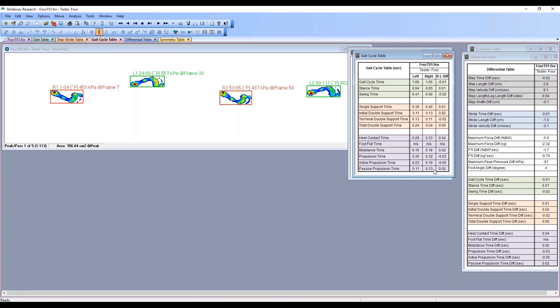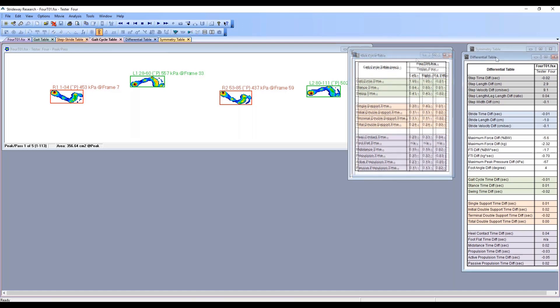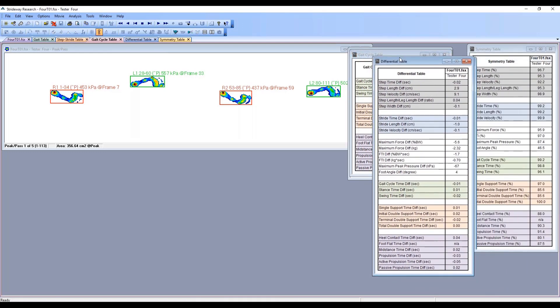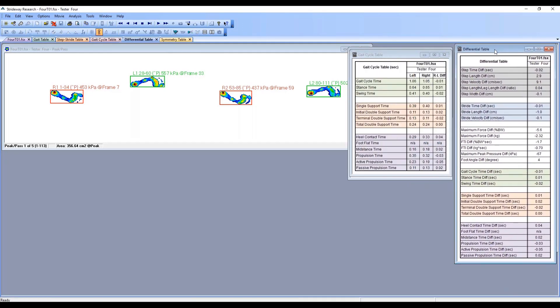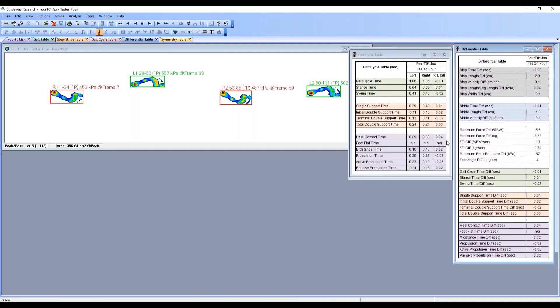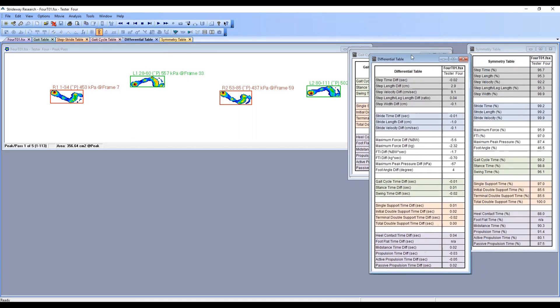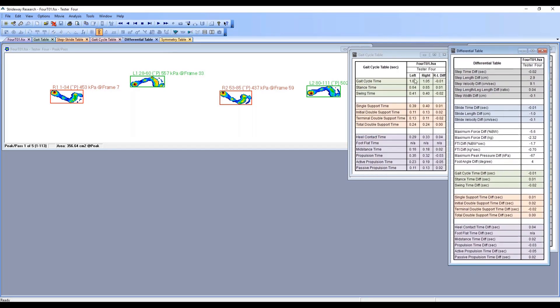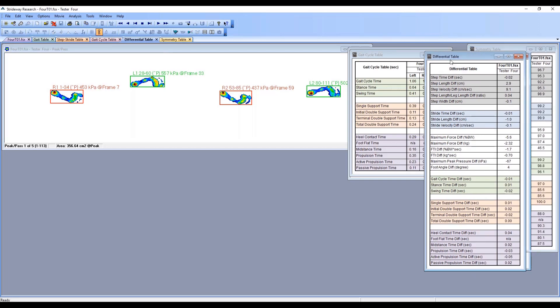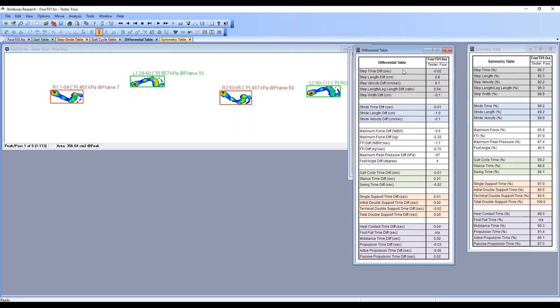We also have the differential table. This calculation that you have here is put into one table if you'd rather look at the difference between the left and the right instead of the actual raw numbers. Keep in mind again that it's always the right side minus the left, so any negative number means the right side is smaller and any positive means the right side is bigger than the left.